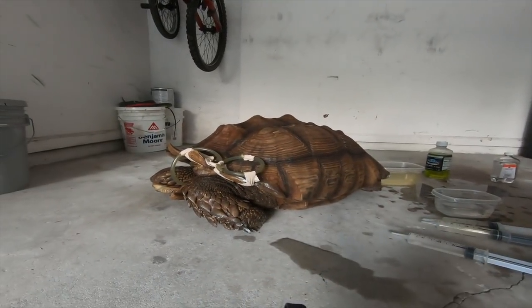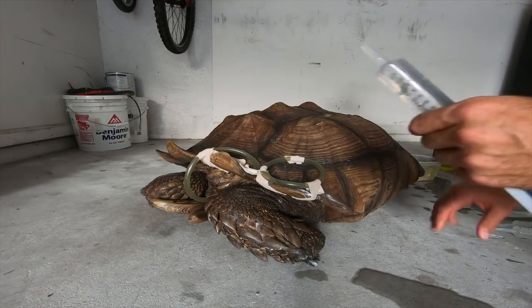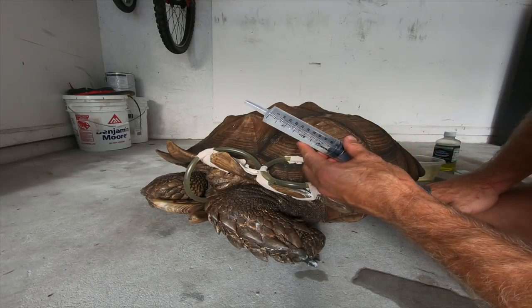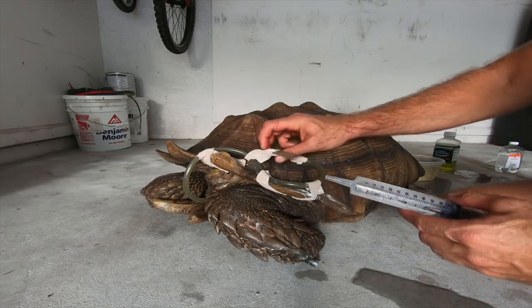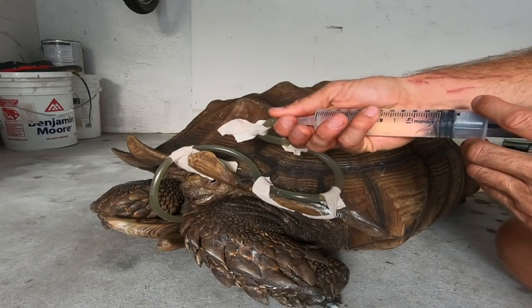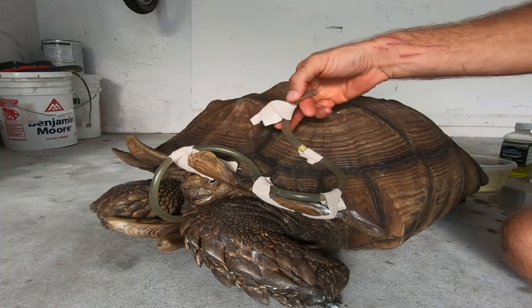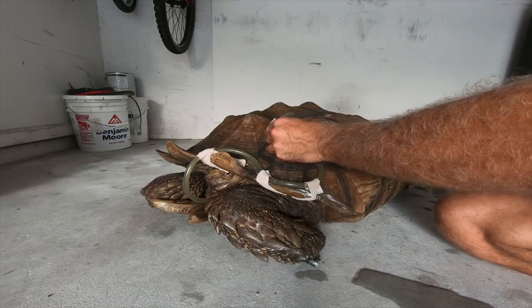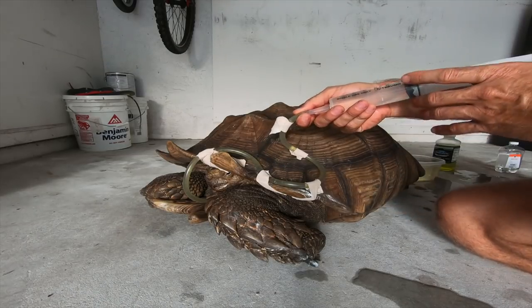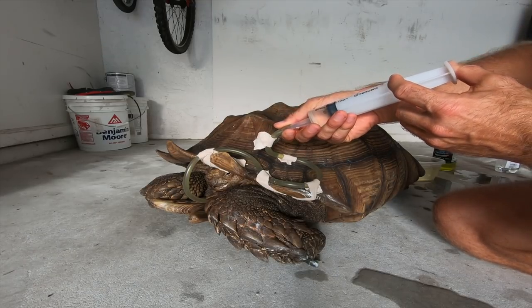All right, there he is, Lumpy. And we're gonna get it moving here, people. Okay, we're gonna start with about 55 milliliters of mineral oil, and you just place it into the tube like this, and we're gonna go ahead and push it in. Just push it right into his little belly, and I wanna keep this tube elevated. And then, because there's not enough mineral oil to go all the way through, you gotta make sure you follow that up with the water.